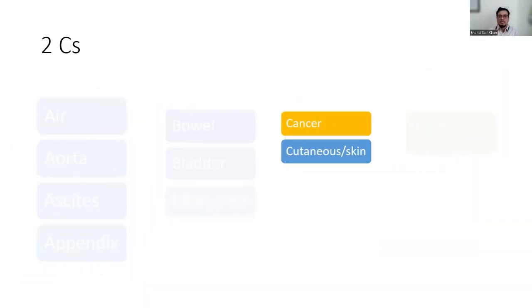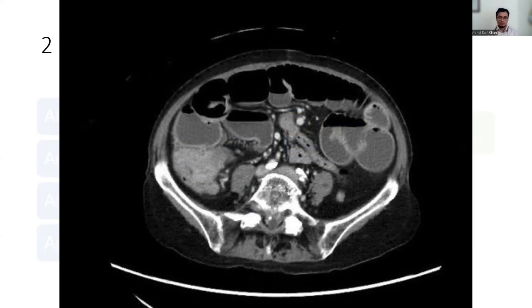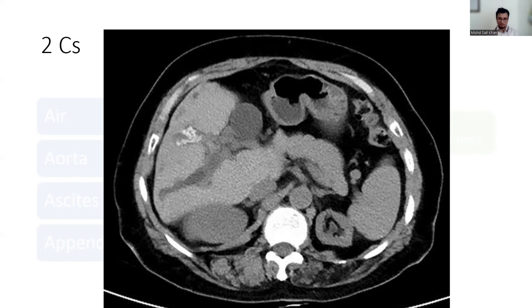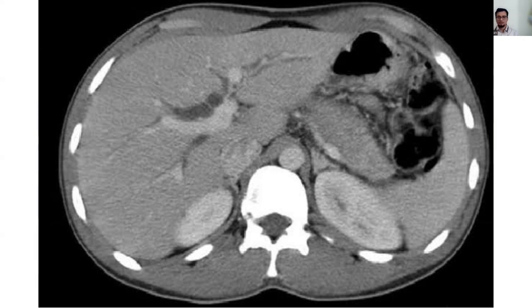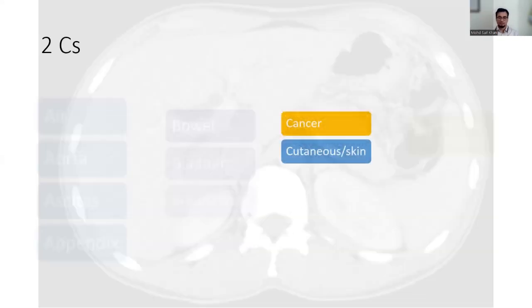Now the two C's — the first C is cancer. In acute care medicine, cancers are usually diagnosed based on their sequelae. When cancer complicates and gives rise to acute clinical signs and symptoms, we find complications on CT — for example, bowel obstruction in colorectal malignancy, or obstructive jaundice in liver, biliary, or pancreatic tumors.